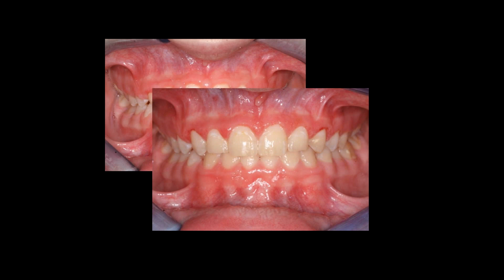So again, flatten the papillas, even things out as much as possible with the anterior teeth, followed our cosmetic principles, and made him, like I said, a new Essex retainer that day so we could hold those contours as the tissue healed.